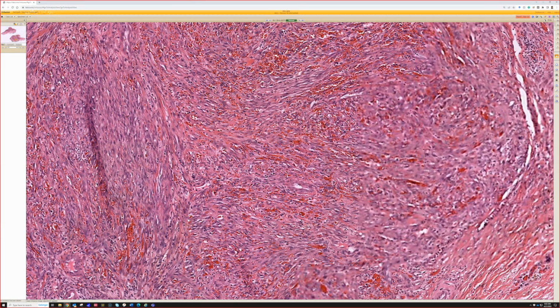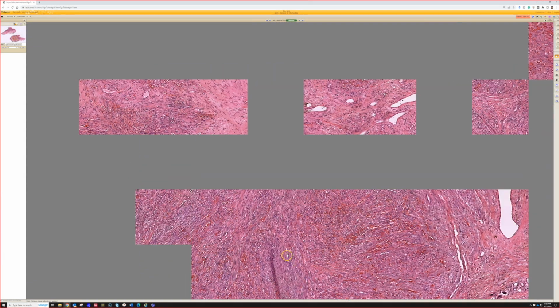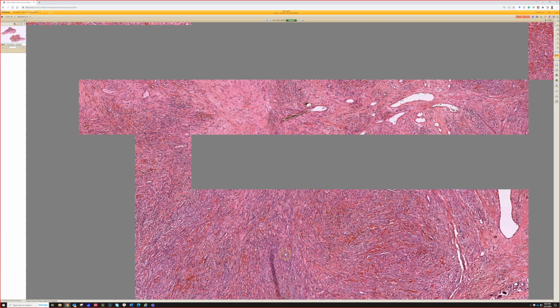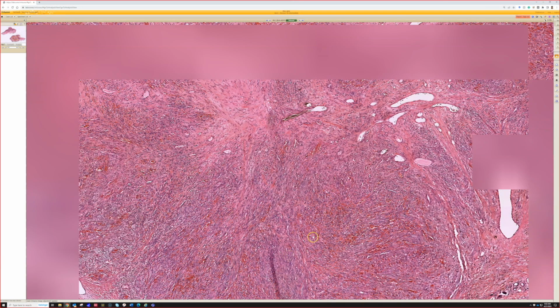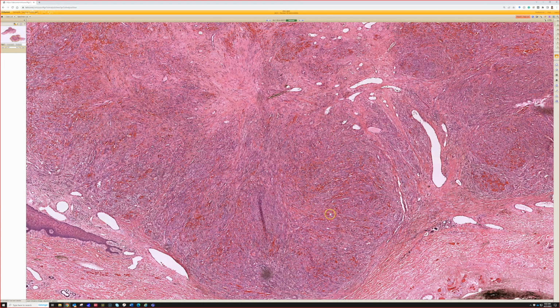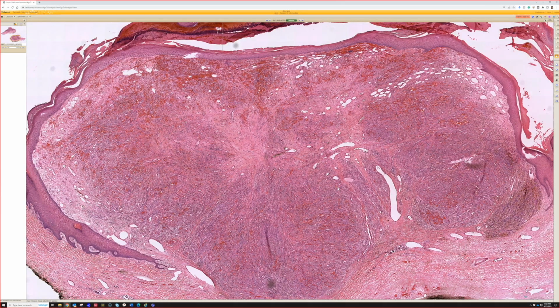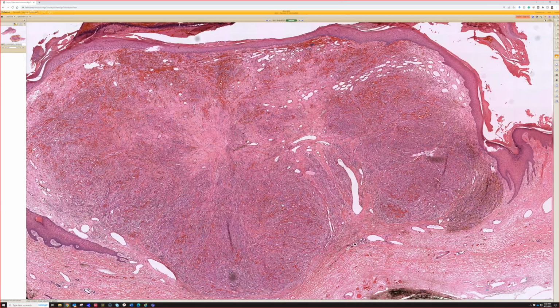And so those are the different types of Kaposi from their scenarios. Then there's also three different stages, if you will, or presentations. There's the patch form, there's the plaque form, which looks like a plaque, and then there's the nodular stage of Kaposi, or tumoral stage, if you like to think of it that way. And that's what we're looking at here, the nodular form of Kaposi. I have no way to tell what type of setting, if this is arising in a classic form in an elderly adult on the lower leg, or if this is because of HIV. I have no way to tell microscopically which one we're dealing with. But I can tell that it's probably the nodular presentation because it's a nodule, right?